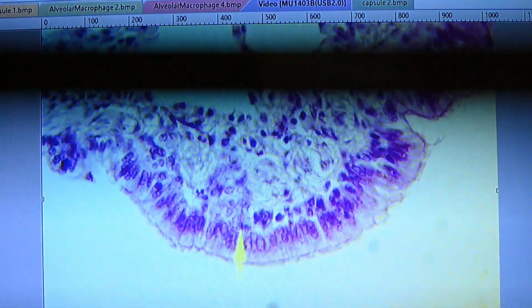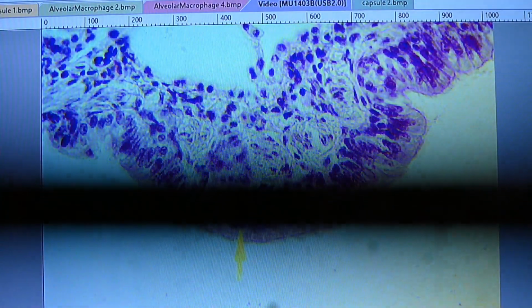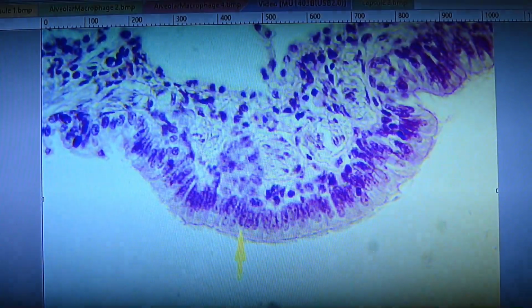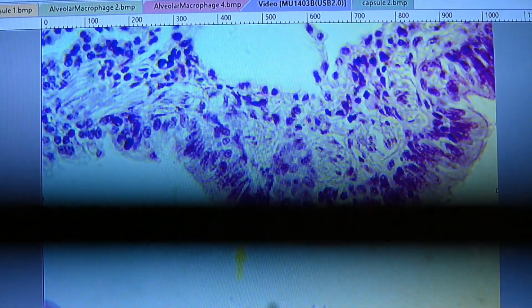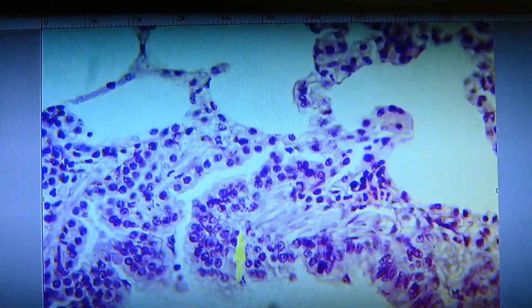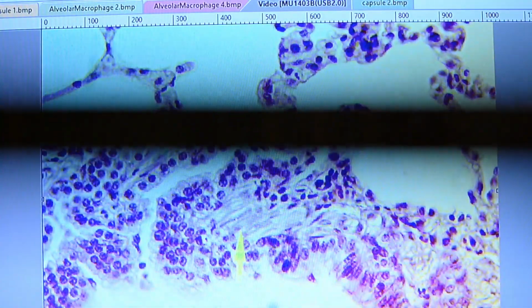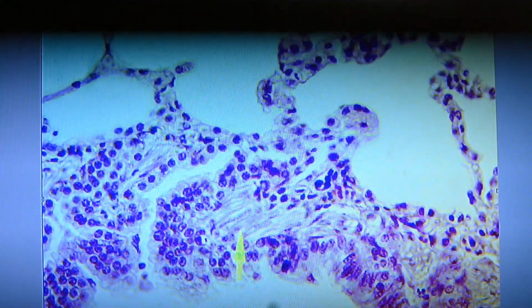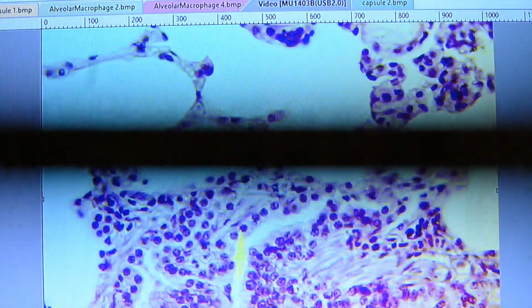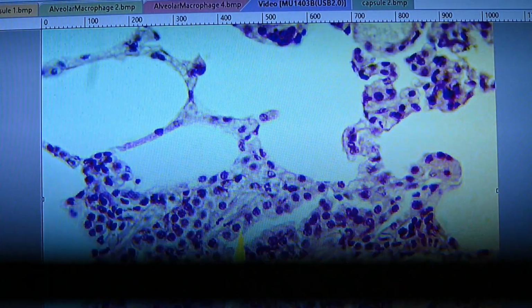Okay, in this bronchiole, at this point, our epithelium is not as tall. We don't have as much of that pseudostratified organization. We have something a little more columnar in shape, columnar cells along the edge, ciliated columnar cells right here. Bits of smooth muscle still worked in there here and there. There's some smooth muscle cells and a patch right there near the middle of the screen. Down in here, we're getting some simple cuboidal epithelium in some of these pockets off the wall of this bronchiole.